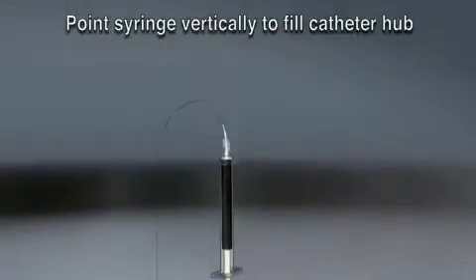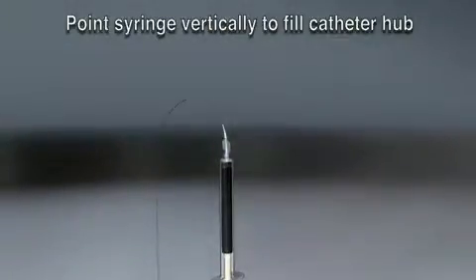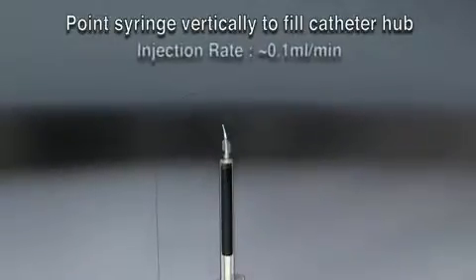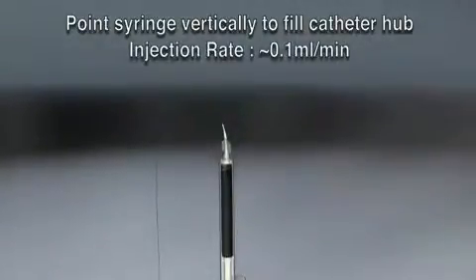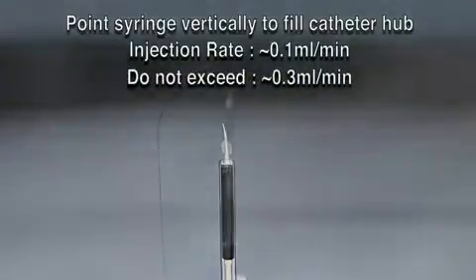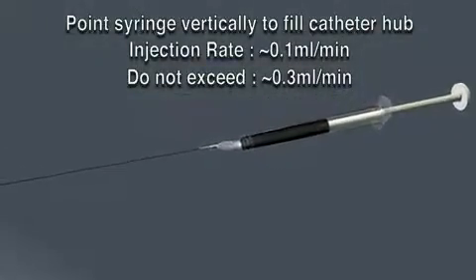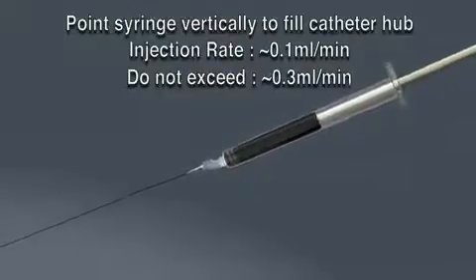Begin injecting the Onyx to displace the DMSO. It is recommended that Onyx be injected at a slow, steady rate of approximately 0.16 milliliters per minute. Do not exceed 0.3 milliliters per minute. Be sure to avoid overpressurization. Once the Onyx passes through the hub, hold the syringe in a more comfortable position and continue injecting Onyx at the specified rate. Begin fluoroscopic imaging just prior to displacing the catheter dead space volume. If visualization is lost at any time during the procedure, halt Onyx delivery until adequate visualization is re-established.